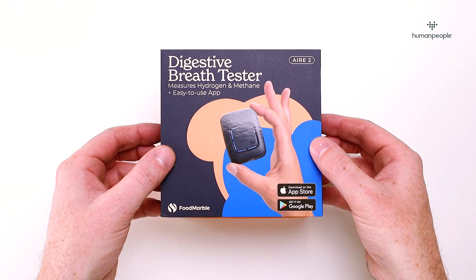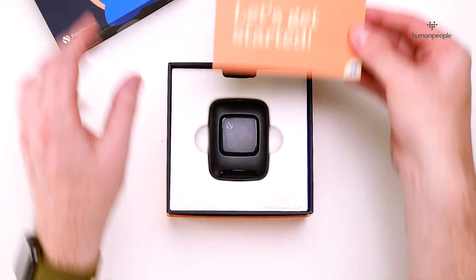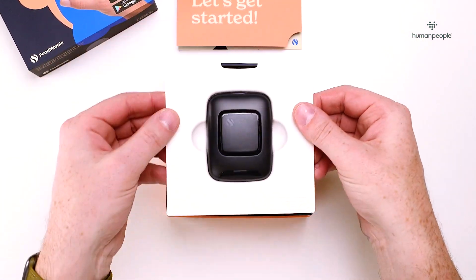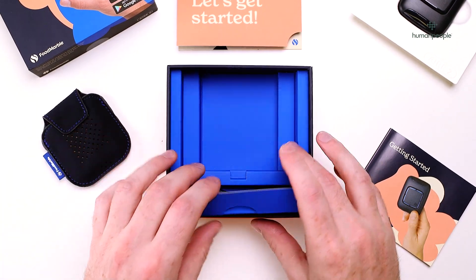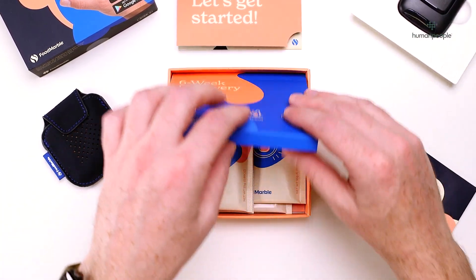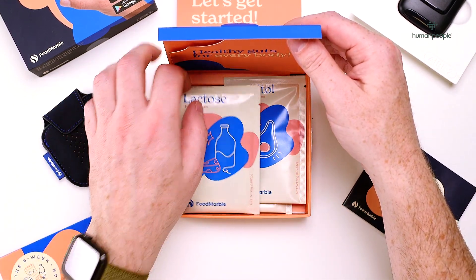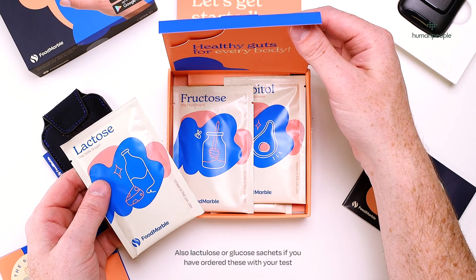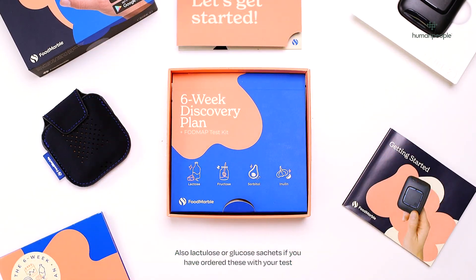On the top layer you'll find a quick start guide, the FoodMarble device, an instruction manual, carrying pouch, and USB charging cable. On the layer below you'll have further information on the six-week discovery plan, and lactose, fructose, sorbitol, and inulin sachets. We suggest charging your device before moving on to the next step.